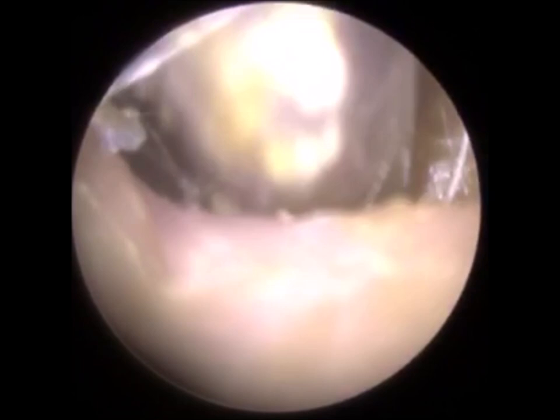So you can just see his eardrum, just to where I am now. Behind that, that's his eardrum, and on the right hand side, and it is very difficult to see because the patient has had surgery, but there is a perforation there to the right. I'm just zooming in there. I hope that was visible. It is difficult, as I said. Patient's had a lot of surgery to his ear, so he's got an abnormal shaped ear canal, but hope that was visible, that perforated eardrum.